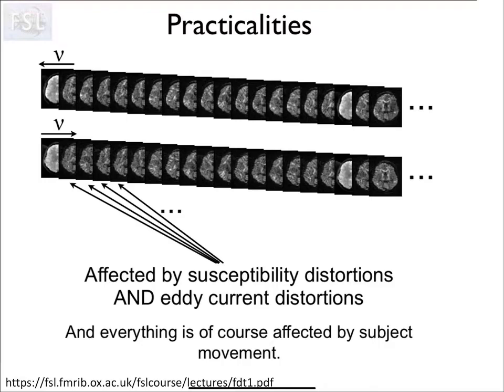Is it possible to have a tract make a sharp turn within a single voxel? I guess I'm wondering, would it be common for a single tract to turn within a voxel and then give multiple diffusion directions? You mean to make a bend? Yeah, just make a bend within a small voxel. Does that happen? Yeah, I mean, it can certainly happen. And there again, it depends on the resolution, right? The fatter your voxel is, the more likely that is to happen.